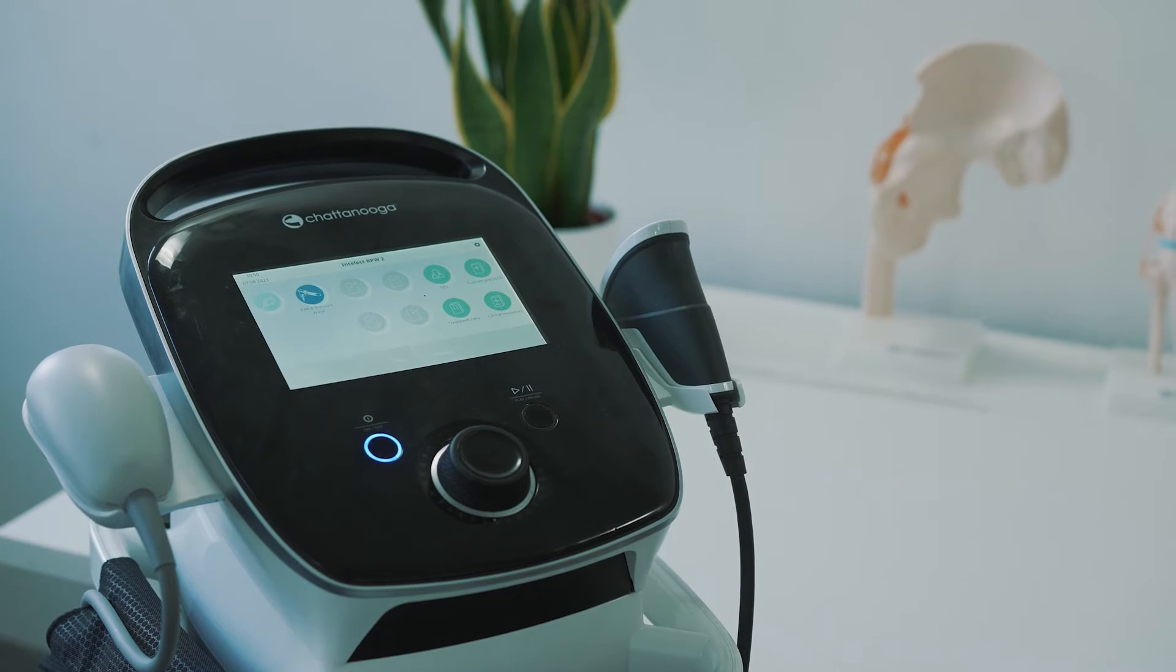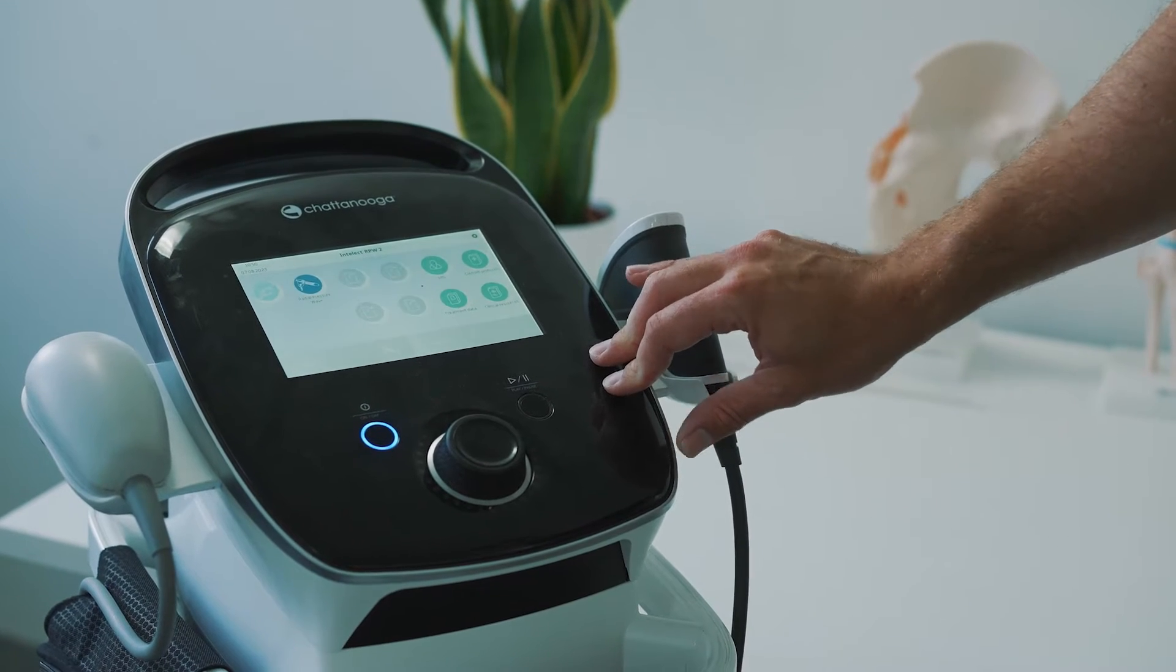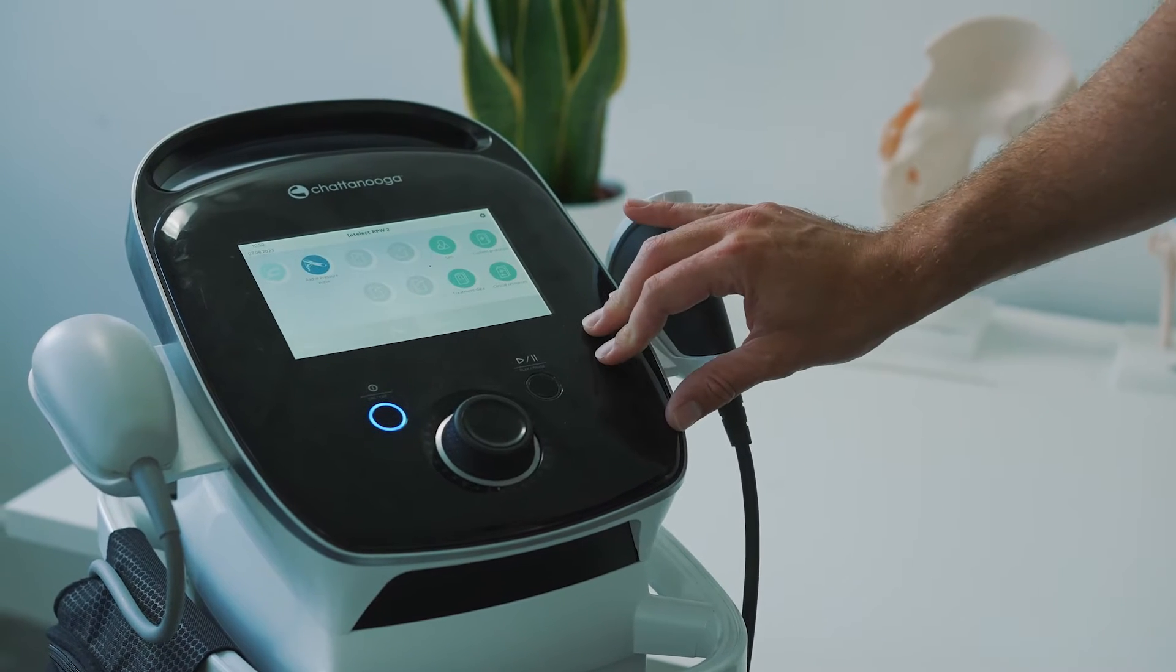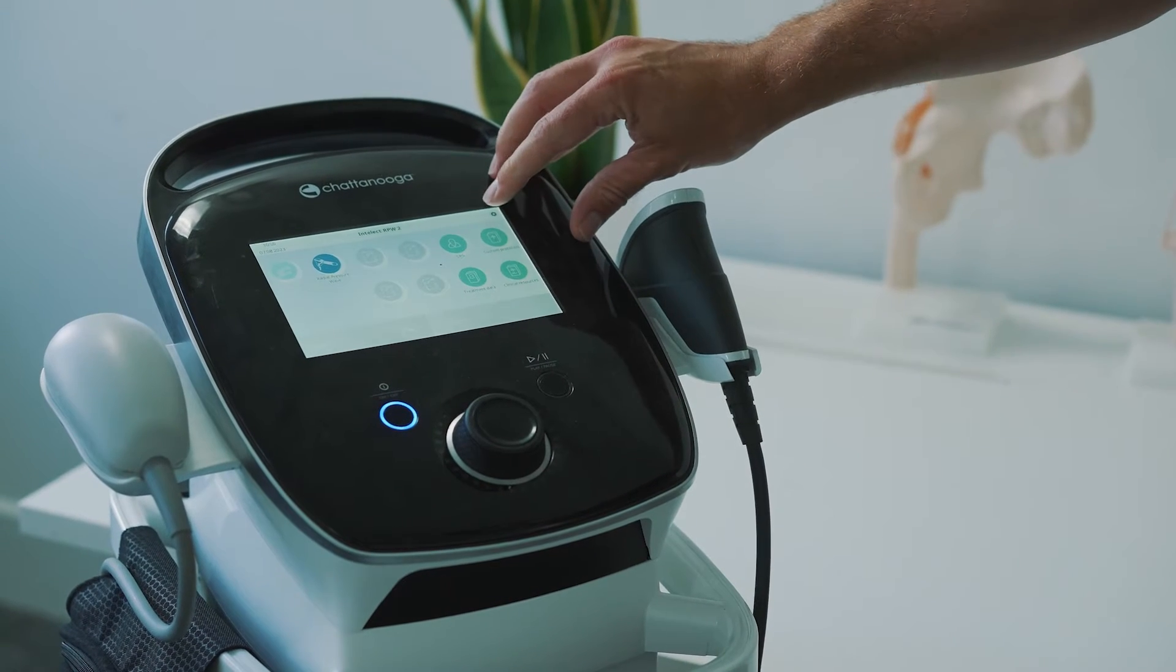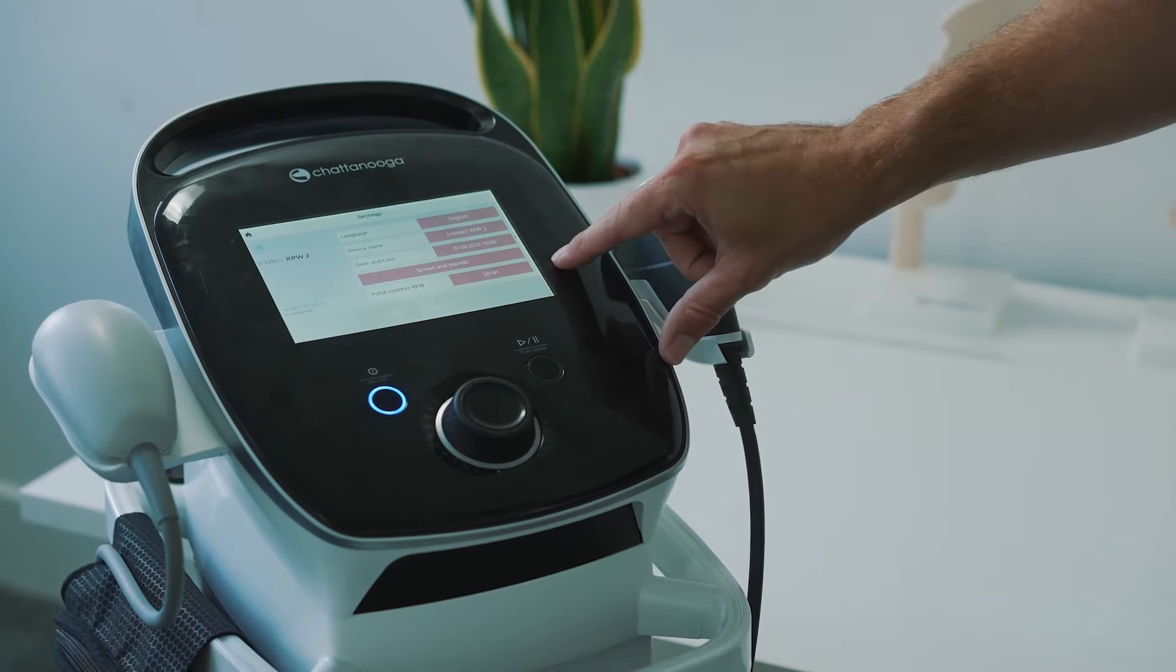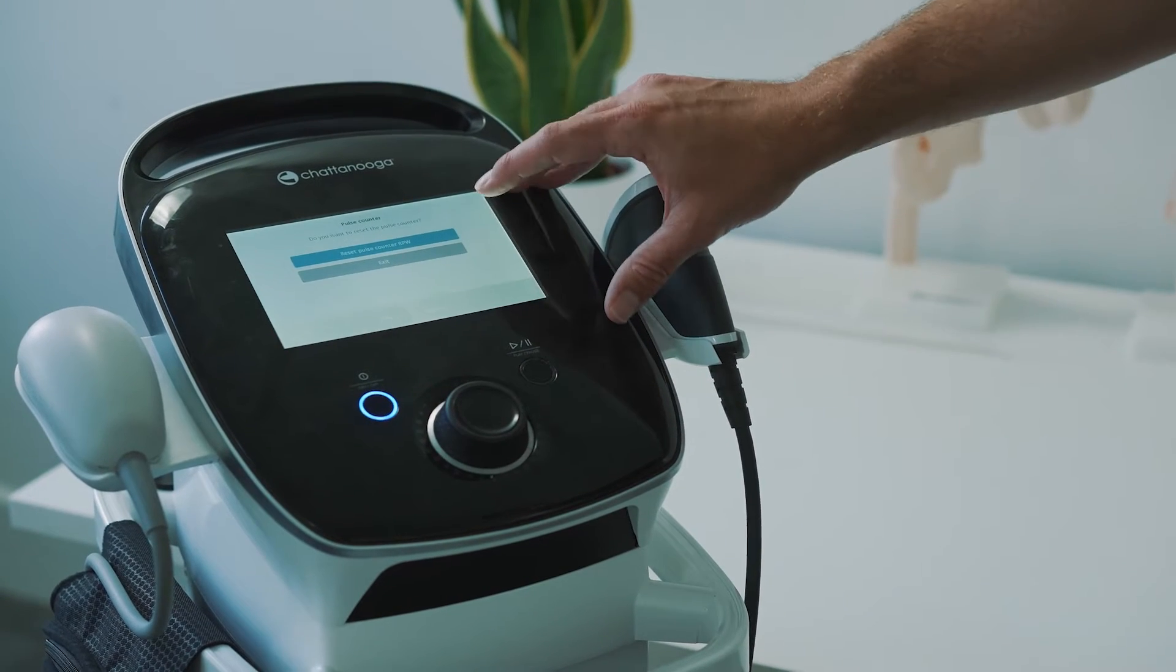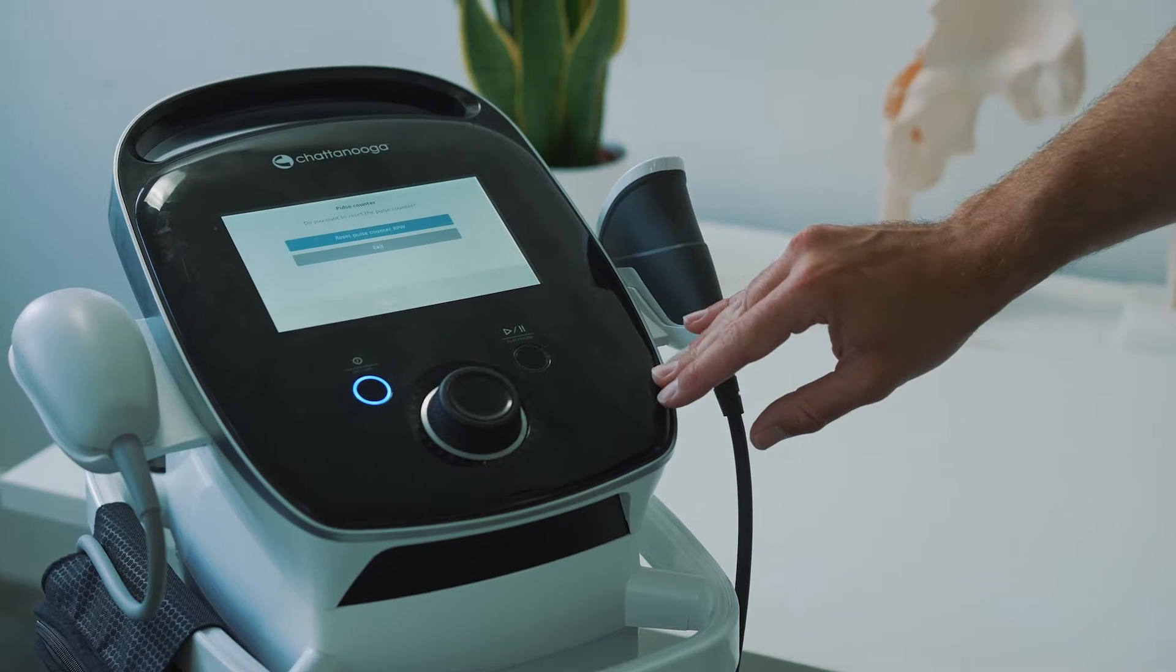It also has clinical protocols for a wide range of indications. Your Intellect RPW2 will tell you when it hits 1 million pulses and it's ready for a revision, but if you want to check the pulse counter yourself, click the cog in the top right hand corner. The pulse counter is displayed at the bottom of the screen. You can select here and once you've completed your revision you can reset the pulse counter.